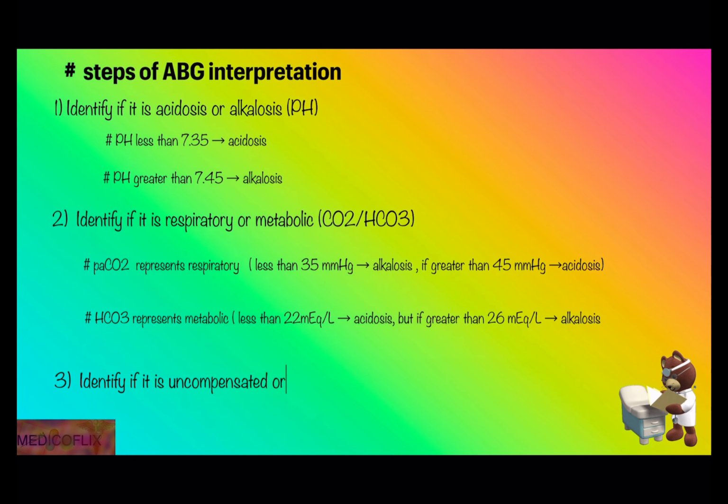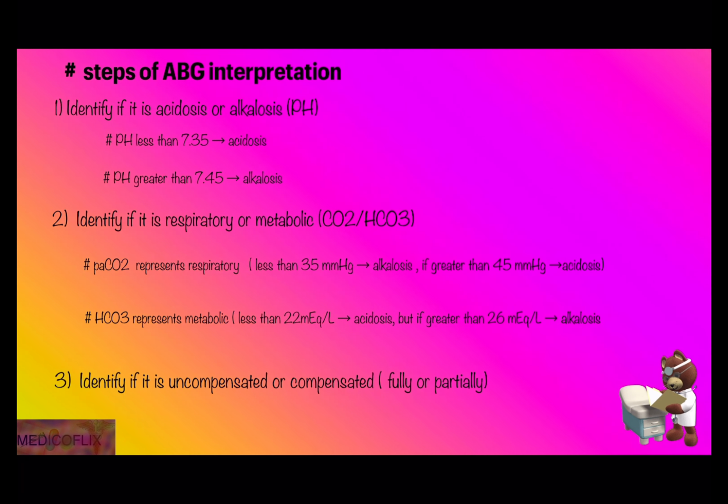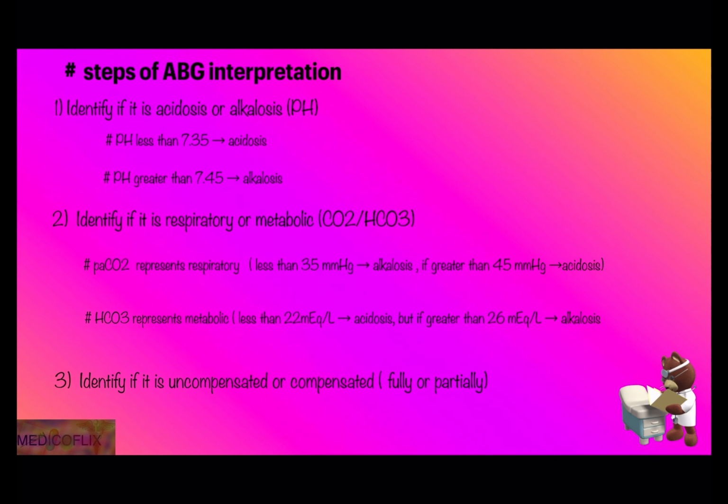Step 3. Identify if it is uncompensated or compensated. If compensated, it's fully or partially.